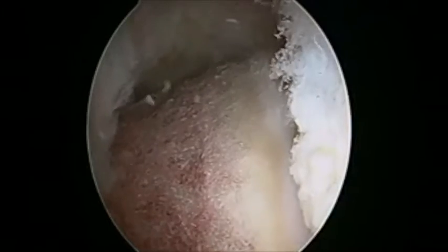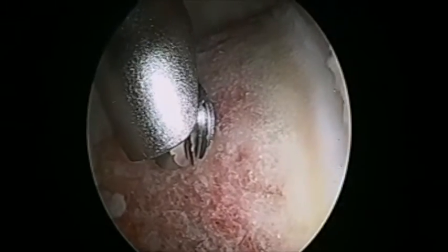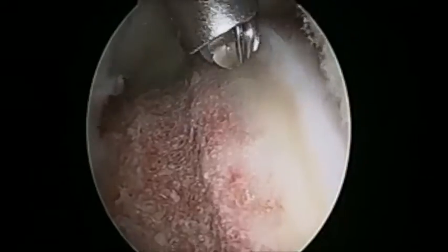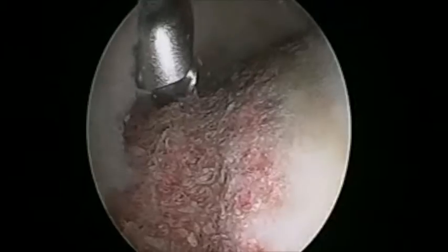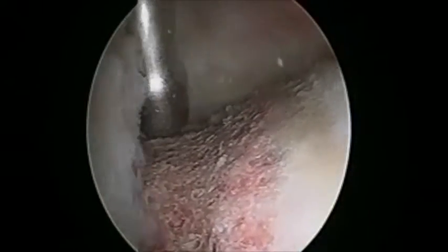Once satisfied with our resection, we then inspect the resection both directly and fluoroscopically. In this instance, it was felt there was not adequate restoration of the head and neck offset on fluoroscopy. Thus, the process of the two-tier resection is then repeated in a similar fashion.